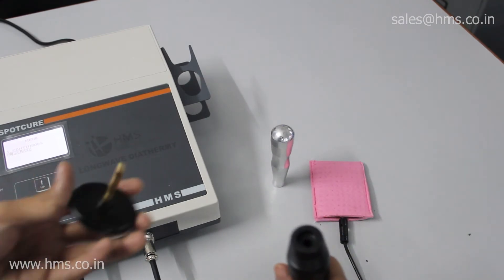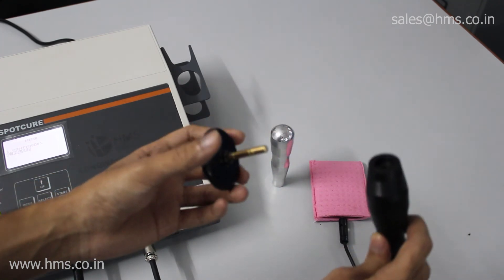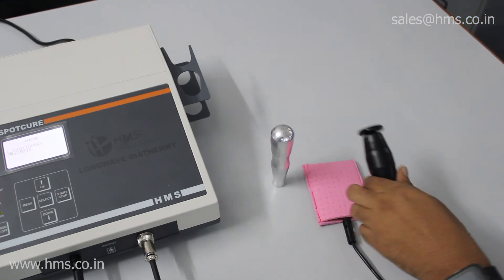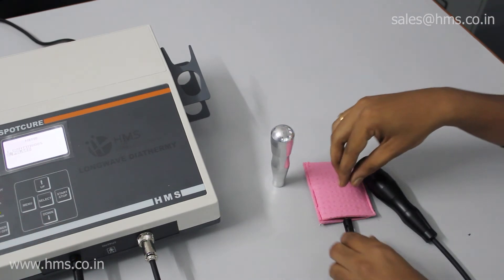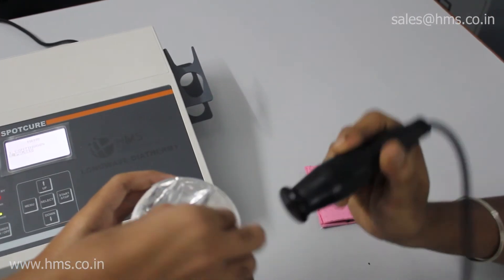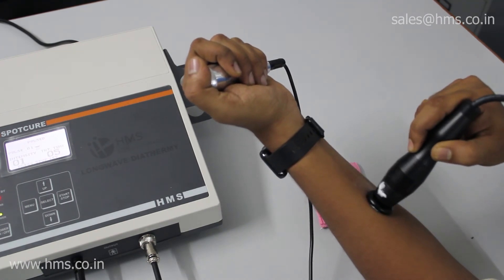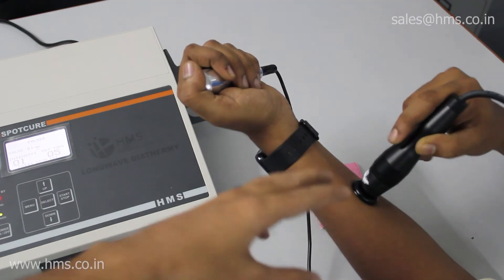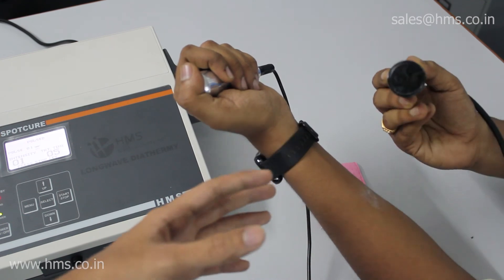This is the probe where you insert the applicators — there are three different types. To insert an applicator, just align it to the hole and press it. It's very simple, and now the applicator probe is ready along with the inactive probe. We'll use the gel for treatment — apply a sufficient amount of gel to the area where there is pain. The applicator size must be chosen according to the surface area being treated, so for the patient's hand we have chosen the smallest applicator.